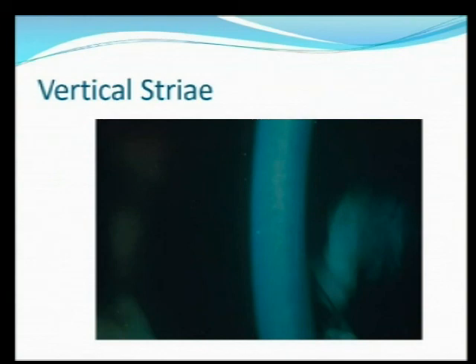All right, when we talk about the slit lamp, we'll talk about a direct focal parallelepiped, or basically an illuminated block of corneal tissue. We're looking straight on, the beam's coming in at about a 45-degree angle. And if you look carefully at this picture, it's almost divided in half. The left-hand side is a little bit whiter in appearance, and that actually is showing you the front surface of the cornea.